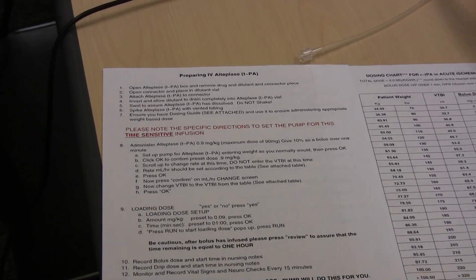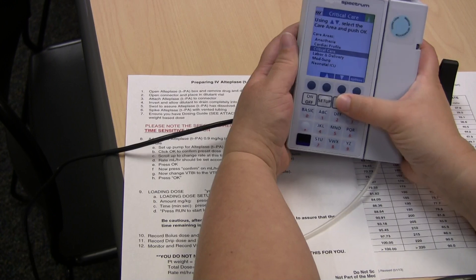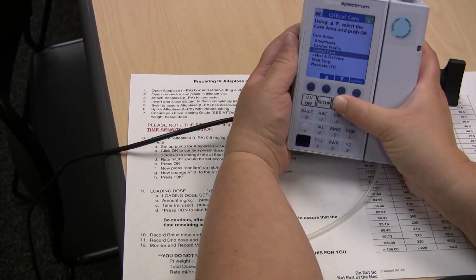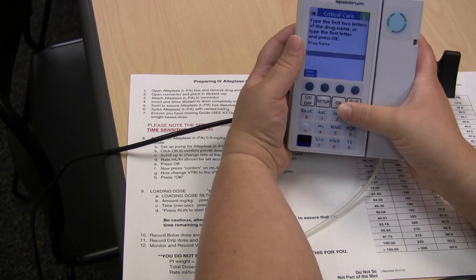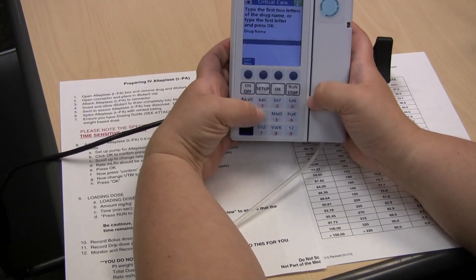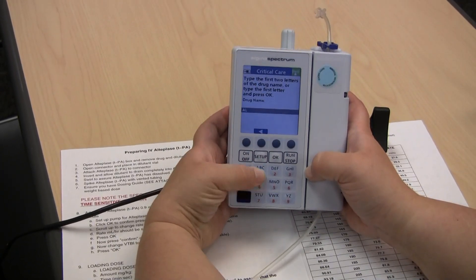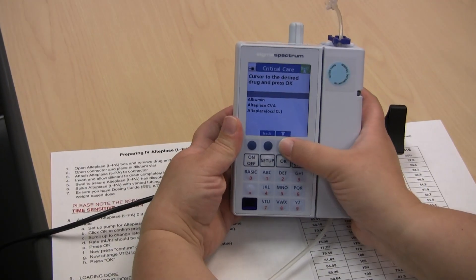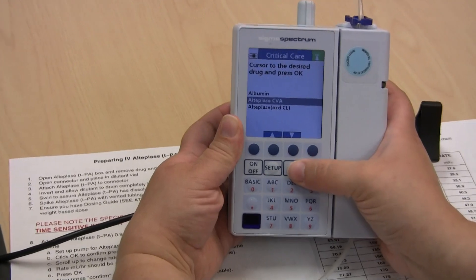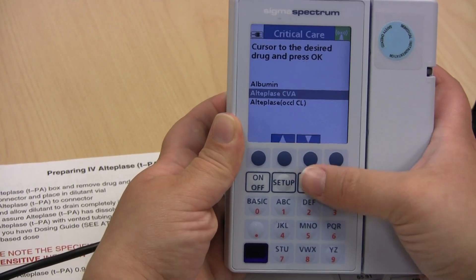Once you have primed and loaded your tubing, you're going to choose the critical care area profile and put in your drug name. You're going to type in the first two letters: AL. Scroll down to choose Alteplase CVA. Do not choose the line occlusion alteplase.